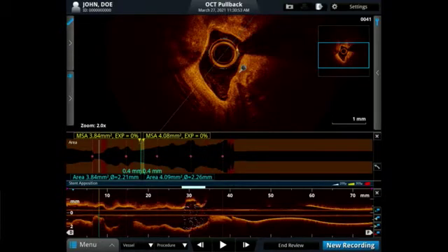Yeah. So I think this is a combination, like a deep calcium that's touching the lumen that's thick, as well as nodular. It's interesting. You have over 180 degrees. I think Shockwave would be worthwhile to try, but I think any atherectomy, whether it's rotoblade or orbital atherectomy or Shockwave, would be interesting here. Yeah, it may be that you require a combination of atherectomy with CSI and then Shockwave. It's a very interesting lesion.